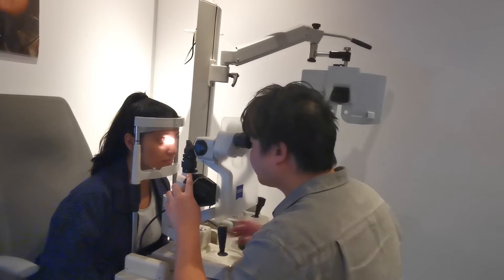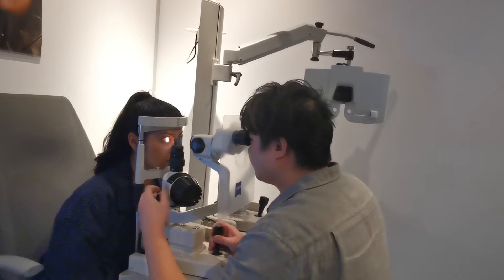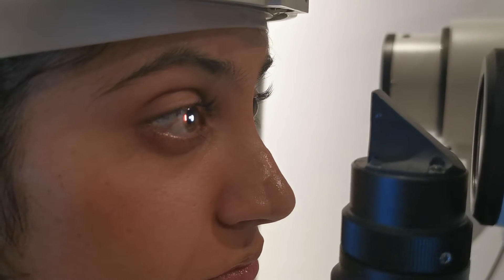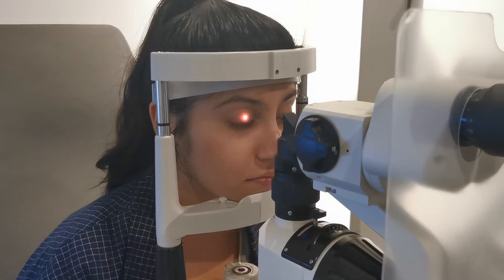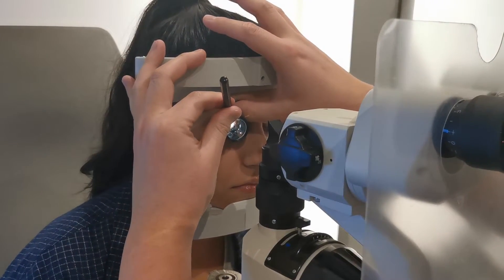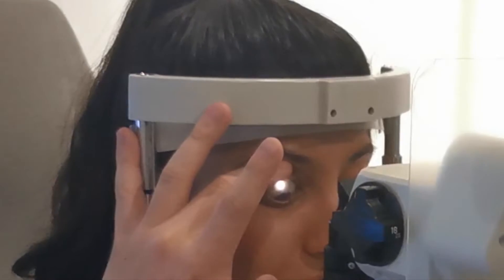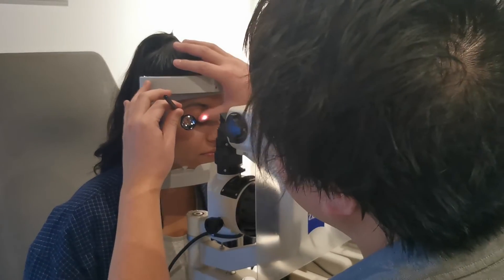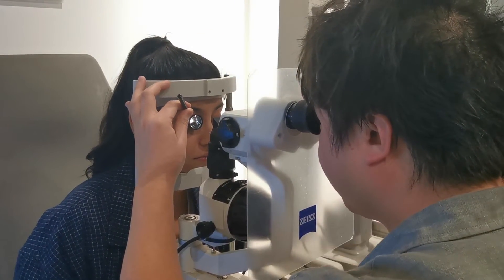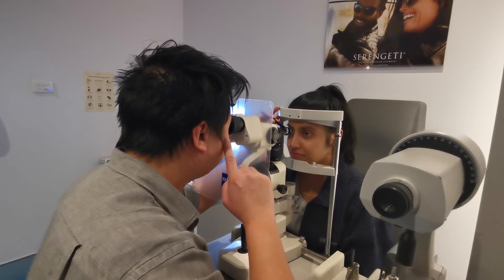Get the patient set up normally as you would for a slit lamp examination. Make sure the room is as dark as possible. Center your slit lamp beam on the patient's iris, and you're looking for roughly a medium height beam on roughly 10 to 15 times magnification. Step one in the setup is I get the patient to look down, and then I hold my finger to the bony part of the patient's superior orbit. Once I have that, I place the lens on the patient's superior bulbar conjunctiva, and then I get them to look straight back ahead at my other cheekbone, so that I'll be able to view the angle.